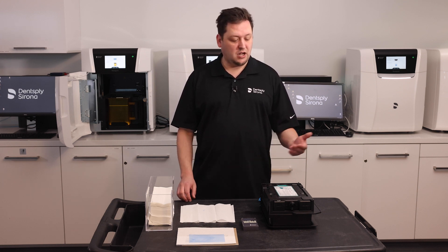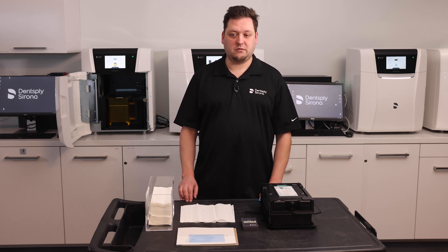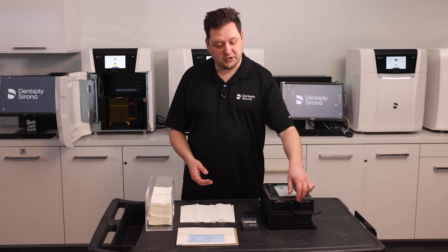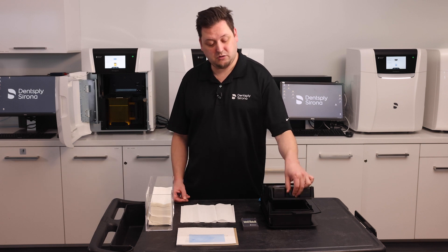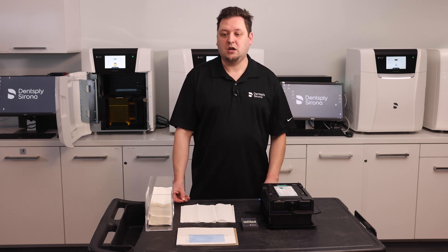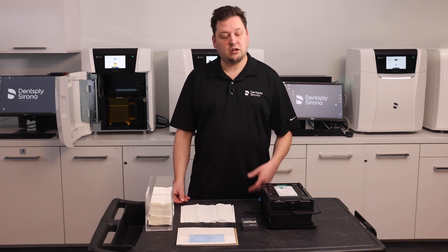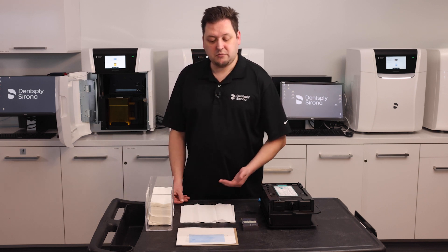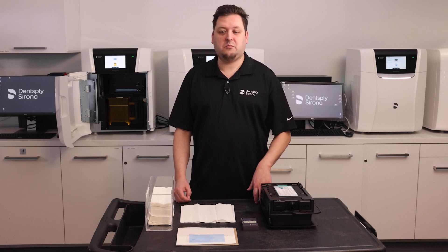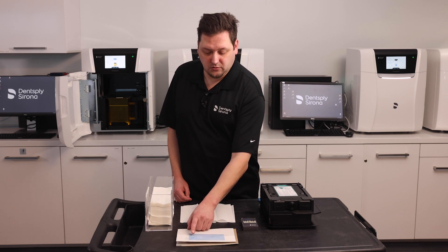In the rare case that an object has fallen into the material unit, here's how you can remove it more easily. Of course you could just look around inside the material vat, but if the object is very small it could be like finding a crumb. However, the prime print does have a process that will help you find such a small object — it's called a cleaning layer. The cleaning layer is a very thin layer of resin printed at the bottom that covers the entire glass plate. The idea being that if there is a small object there, it will be printed into the plate itself.